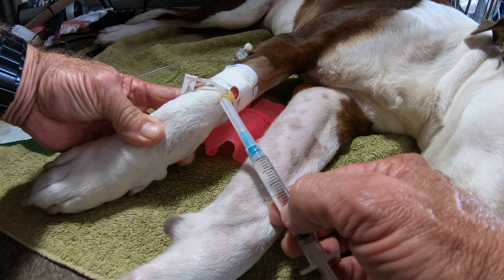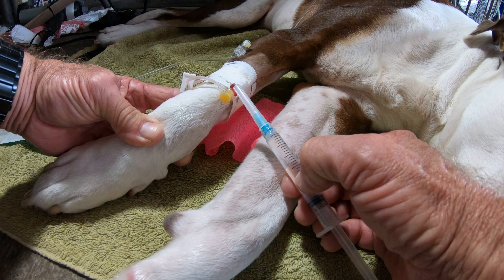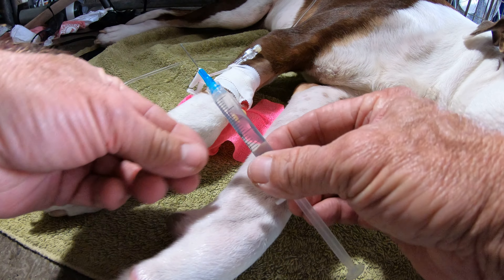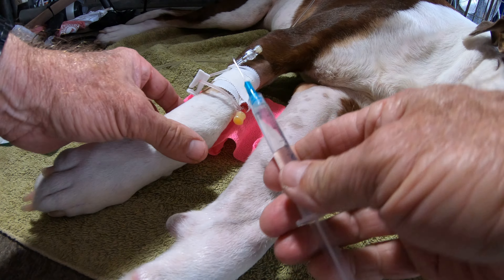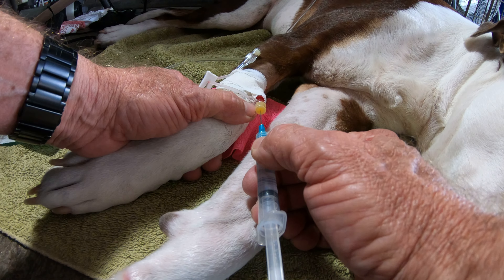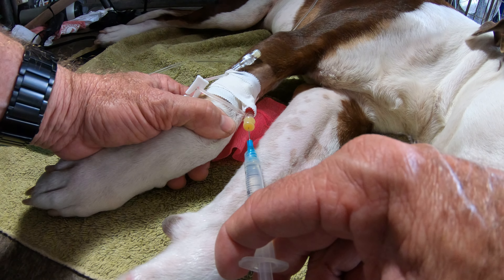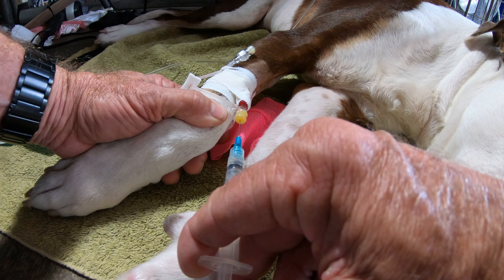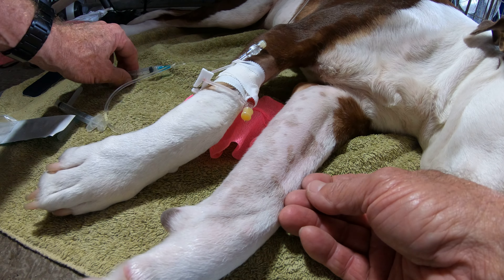It's got a little blood in it because I drew that air bubble out, so the blood came out of her vein and into the catheter to take up that space. Let me double check to make sure there are no air bubbles in here — it's ready to go. I am now going to flush this catheter. The blood is leaving it. I'm finished with this syringe; I'm going to toss it. I don't want it around and it'll never be used again.